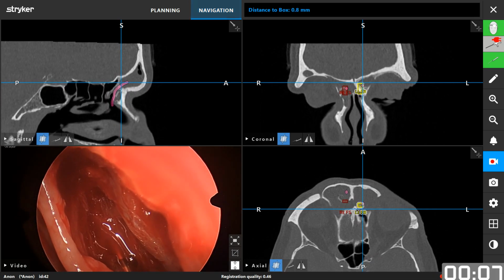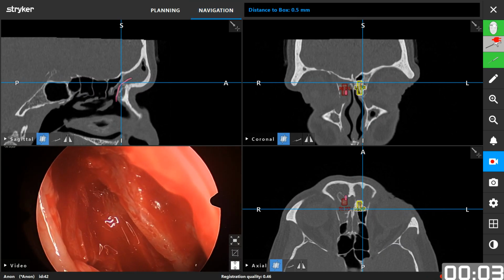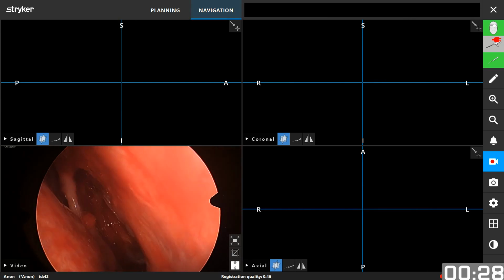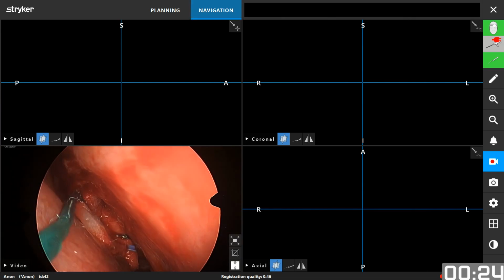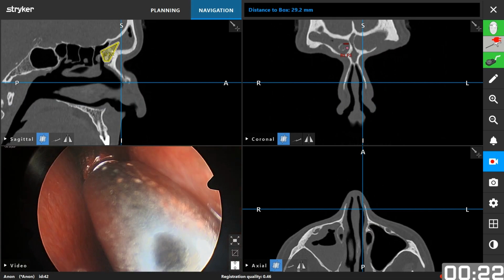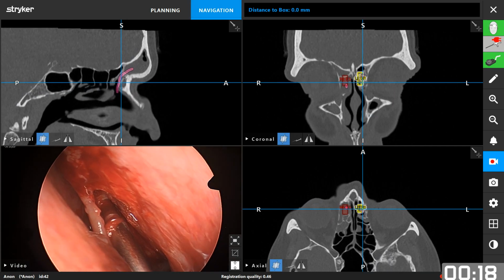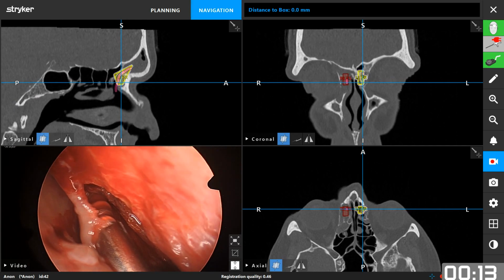And again, to see where the pathway is, all of this thick bone needs to be removed. Usually what you need is just to uncap it, if this is just simple non-recurrent chronic sinusitis, or even a chronic sinusitis with no osteitis. So the bulla is still intact.